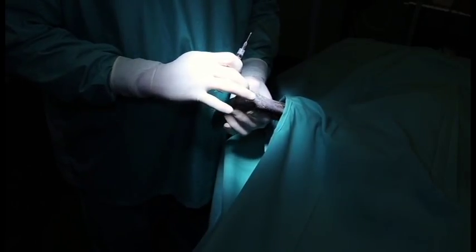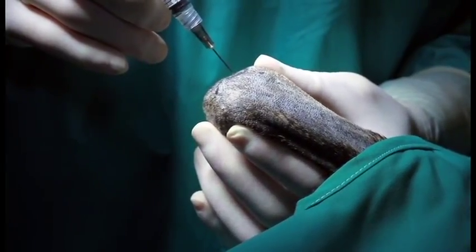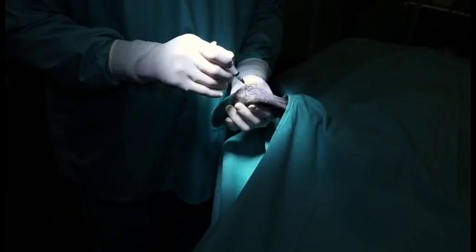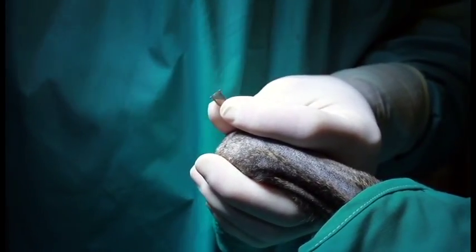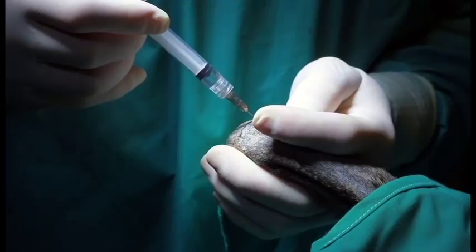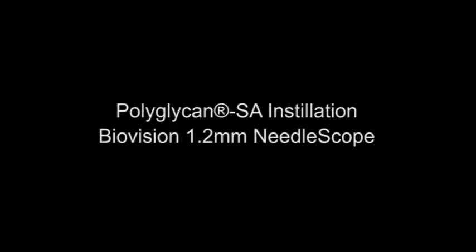With flexion and extension, there is a palpable depression that indicates the radiocarpal joint space. Angle your needle into that depression and slowly insert — this joint is shallow, so you don't have to go very far. For joint injection, simply remove the barrel of the syringe, attach your pre-placed needle to your loaded syringe, and slowly inject. Once injection is completed, release the pressure off the plunger and slowly remove your needle.